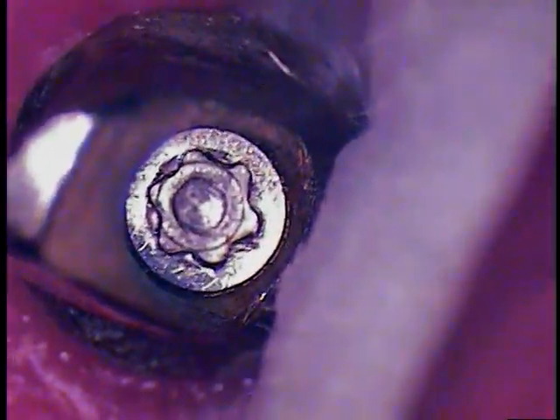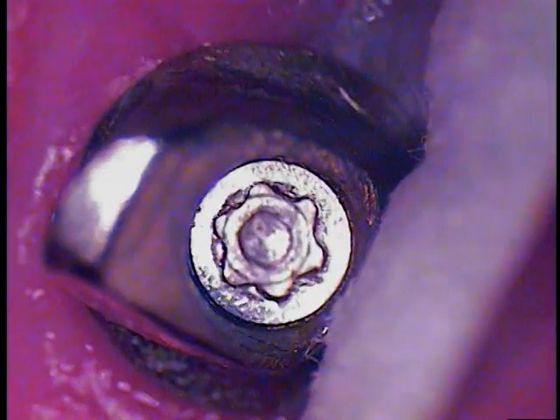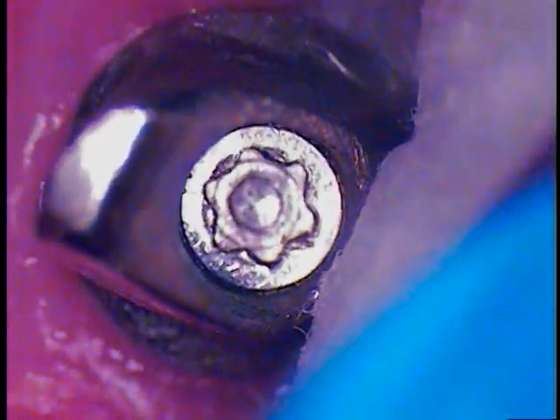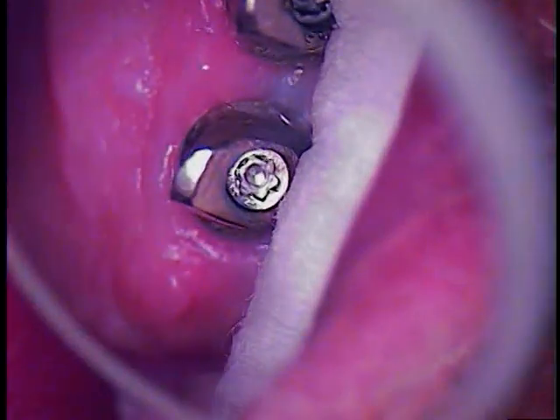So I'll zoom in on that. You can see there's just a little bit of changes occurring, so I would suggest all new screws for the dentist. You can see the star configuration — there are six rounded corners to the star. Now if we look at the one that's got the problem next door, you'll see on number six there was a prior attempt to make that better.